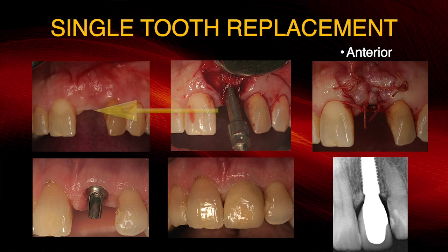Now the lingual side of the crest is keratinized tissue, and that's the tissue that we want to have on the facial surface when we place the implant and the abutment. So the more keratinized tissue on the facial, using the masticatory mucosa, the better it's going to look, and we're going to keep the restoration in line with the adjacent tooth.